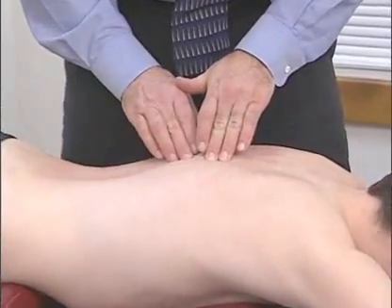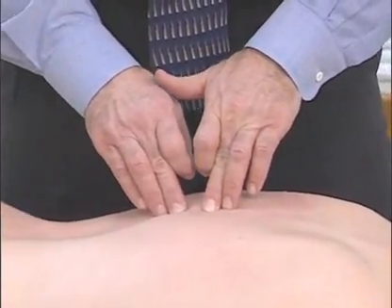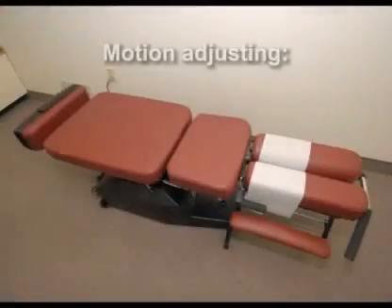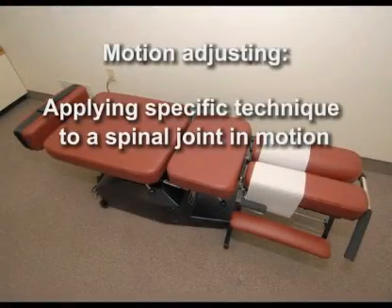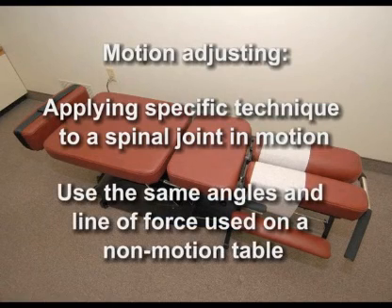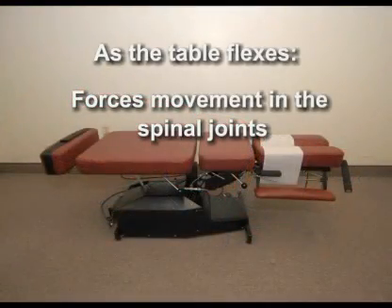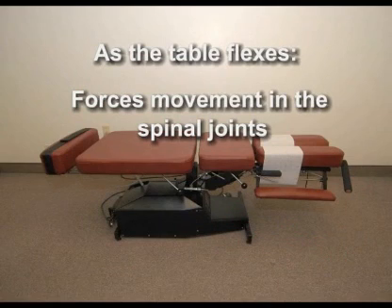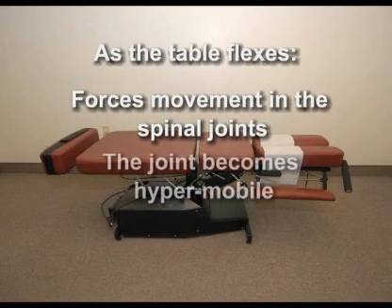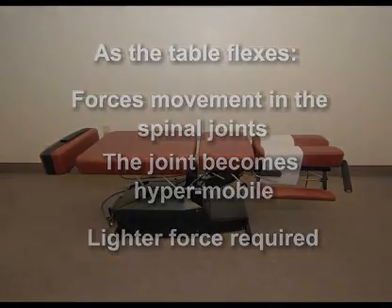After becoming comfortable with applying motion-assisted stretches, you are now ready for motion adjusting. Motion adjusting is applying your specific technique to a spinal joint in motion. Use the same angles and line of force used on a non-motion table. As the table flexes, this forces movement in the spinal joints. With the combination of joint movement and spinal thrust, the joint becomes hypermobile. Thus, a lighter force is required for corrective movement.